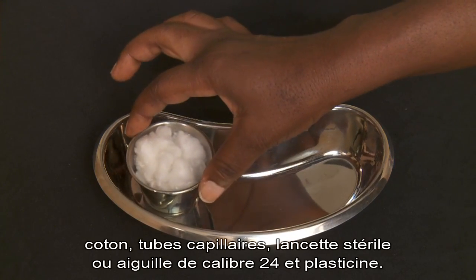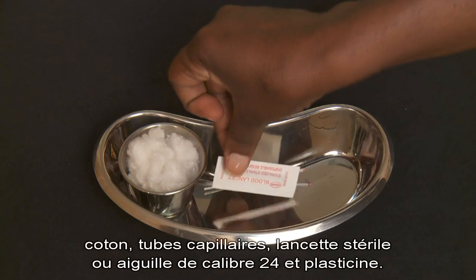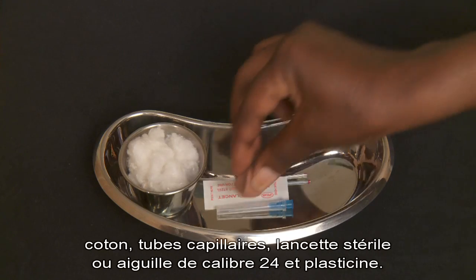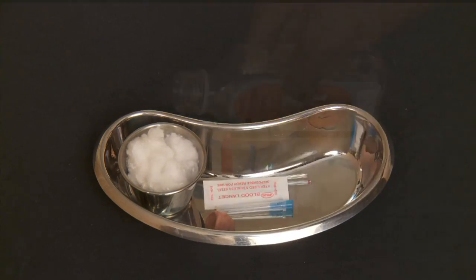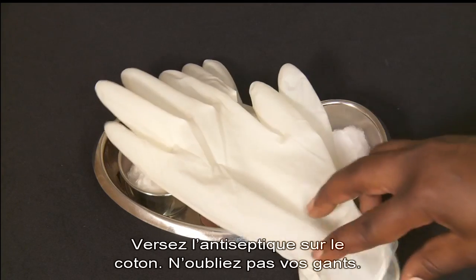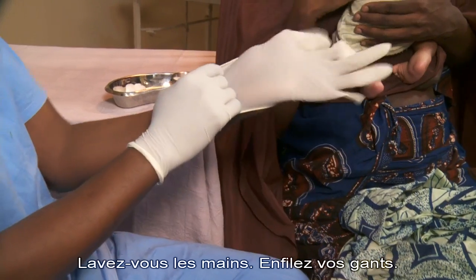Cotton swabs, capillary tubes, a sterile lancet or 24-gauge needle, and plasticine. Pour antiseptic on the cotton and remember your gloves. Wash your hands and put on the gloves.